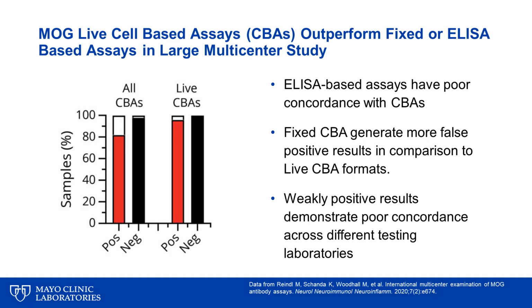Another important take-home point from the study was that there was relatively poor concordance across laboratories for weakly positive antibodies, further indicating the lack of standardization of assays and some of the more challenging aspects of subjective microscopy-based methods, where there tends to be a higher degree of discordance across interpretations.